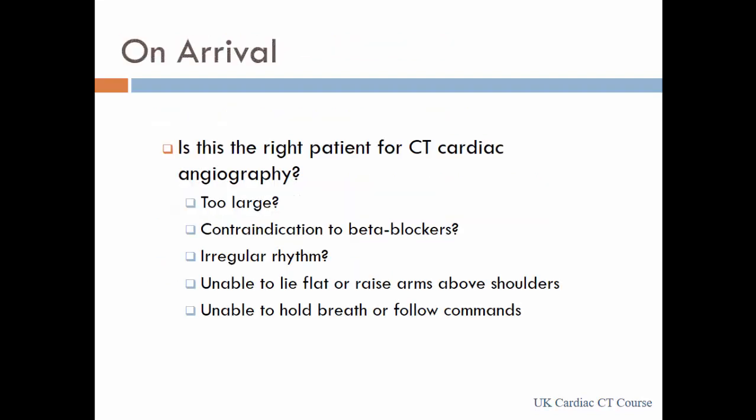And then they assess, is this the right patient for scanning? Is the patient too large? Now, what is too large? It's a very relative thing. We have scanned patients up to 150, 160 kilograms body weight, but anything beyond that, probably the scan would not be of good quality at all.